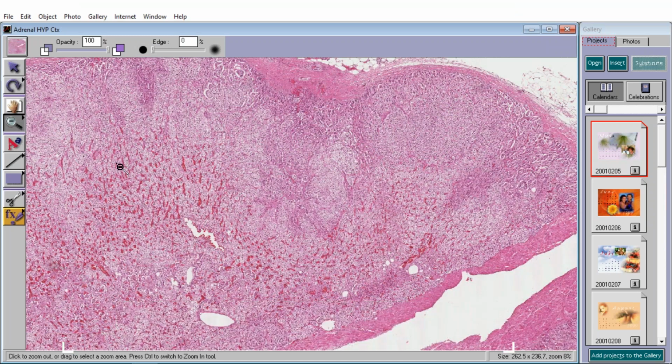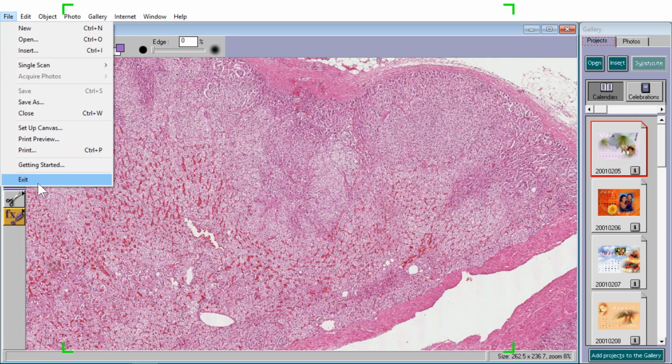Could this patient have been on steroids? The answer is no, because if this patient was on steroids, these external steroids would feed back to the hypothalamus and the pituitary to actually cut off the production of ACTH. So a patient who is hyperadrenal because they're on steroids would have a thin adrenal cortex. A patient who is hyperadrenal because of a pituitary tumor producing ACTH would have a thick adrenal cortex. Okay, I think you're getting the concept here. You know that's not a normal adrenal.